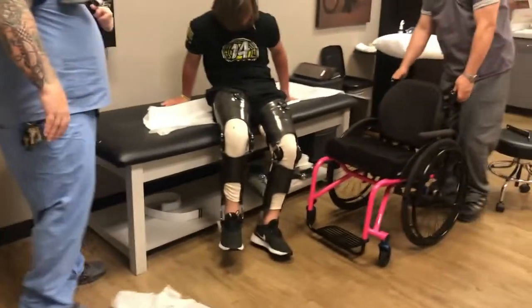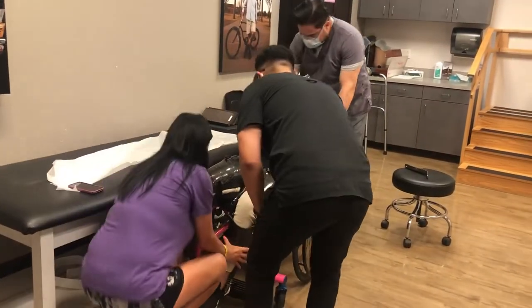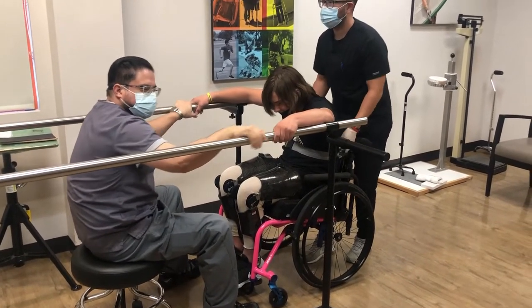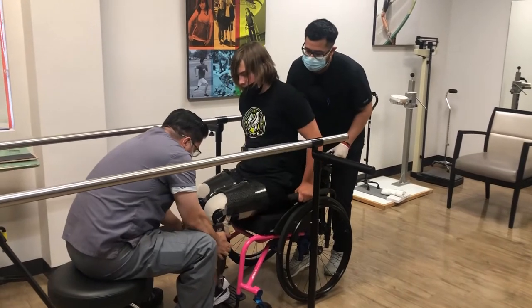When he doesn't have these on you can put it back here. It's just reliable — yes, 400, 600 pounds — and then if you need to scoot forward, there you go.